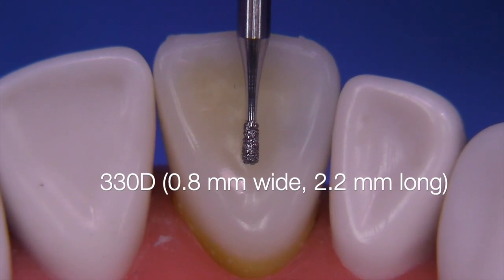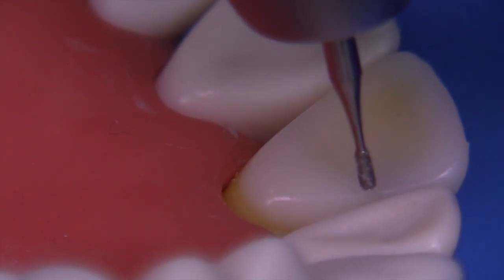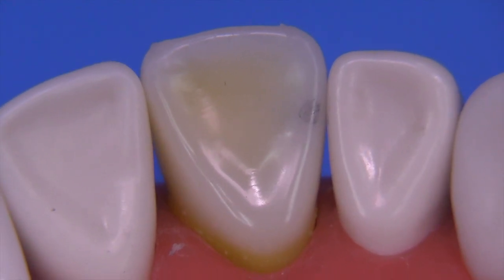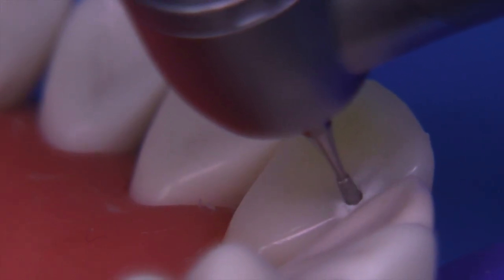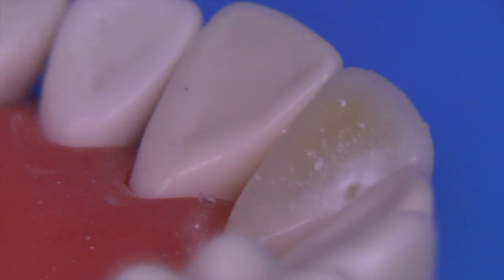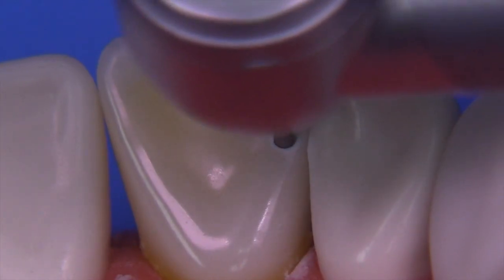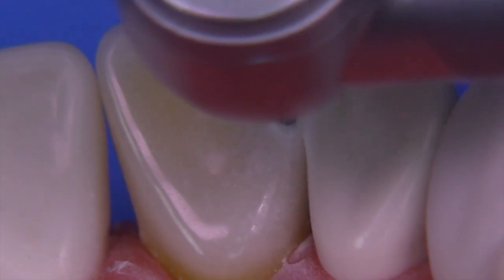I'm going to utilize a 330 diamond. The reason for using this bur is that the enamel structure is very brittle, and if you use a carbide it tends to skip around the surface and can actually cause the enamel to break off. We're going to start the preparation with the bur perpendicular to the lingual surface and make just a punch cut. The bur is about 2.2 mm long, so you can go the entire depth toward the facial without going too deep. Remember to protect the adjacent tooth by leaving a little shell on the distal side, then gently move the bur upward incisally and gingivally to create a slot.